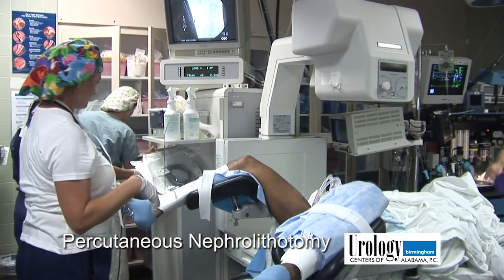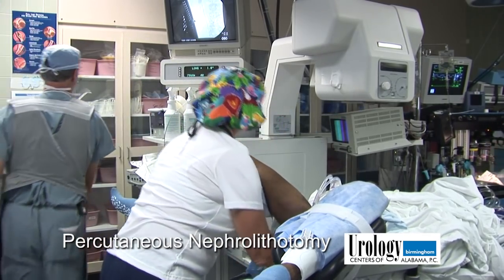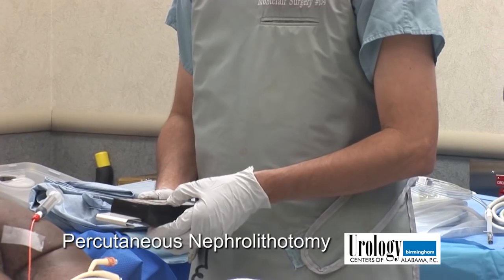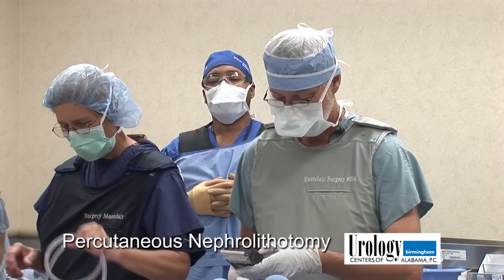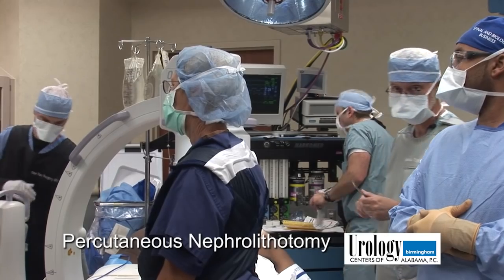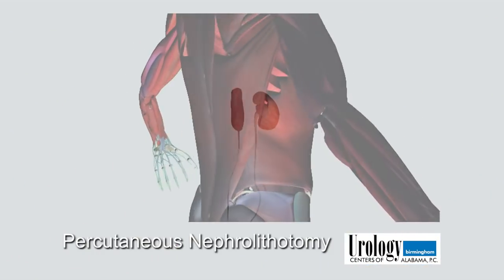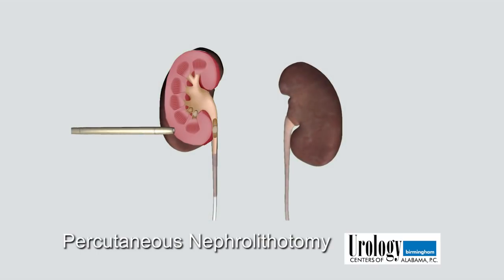Now we're going to move to the open room and start the access part of the procedure. A crucial part of the case is getting the patient in the correct position, so we spend a good deal of time positioning them so we'll be able to get into the proper spot of the kidney. The next step is we're going to rotate the C-arm as far as it'll go, so when we make our needle stick, we're going to be in an avascular plane in the kidney, and that cuts down on bleeding.